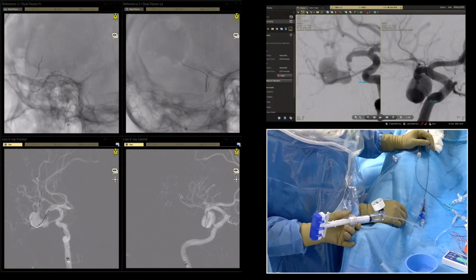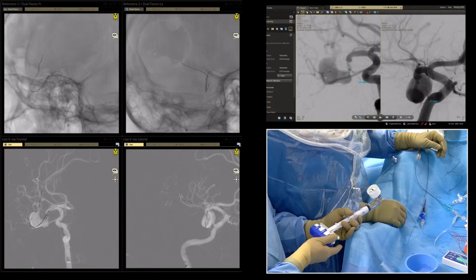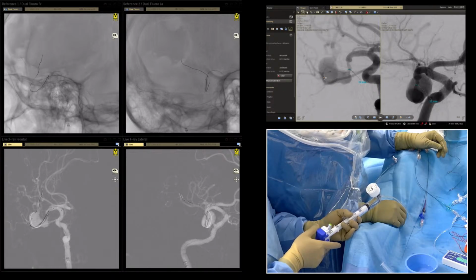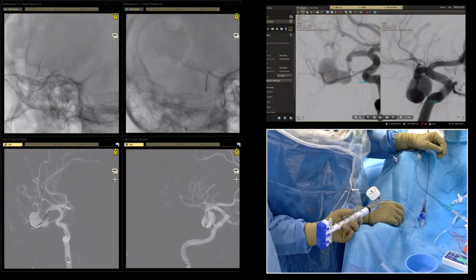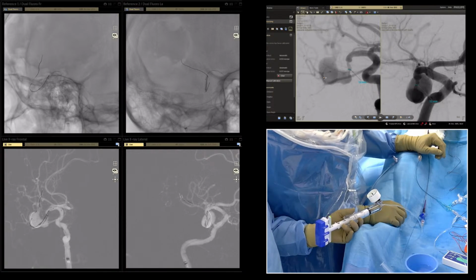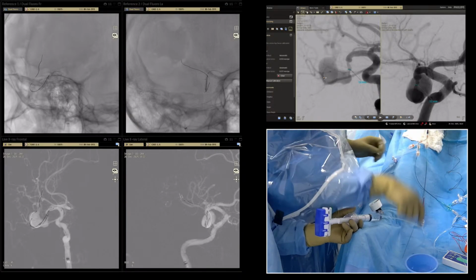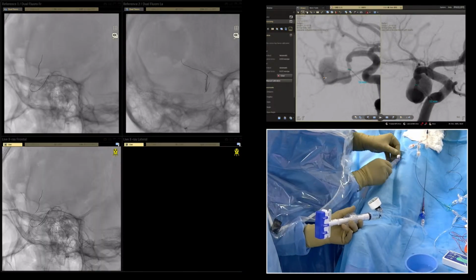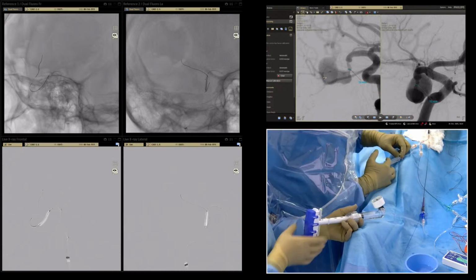Тогда чуть-чуть держи. 12 бересің. We'll give 12 atmospheres. Без напряга? Вон напряжение восстало. Все, стоп. There is a little bit of tension on 10 atmospheres. At 10 atmospheres, the balloon became 2.33. Okay. Сдувай. Okay.